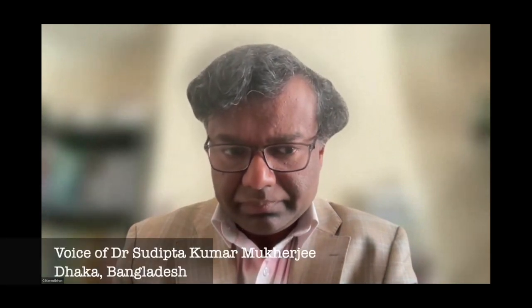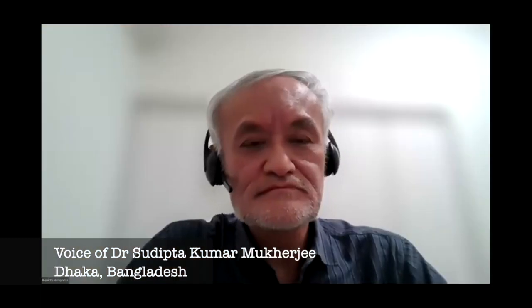Thanks for giving me a chance to ask a question. My question to Professor Kenichi is: you told us that you use neuronavigation during the endoscopic procedure. Can you use neuronavigation for your flexible endoscope? No. With the flexible endoscope, we cannot connect to the neuronavigation, of course.